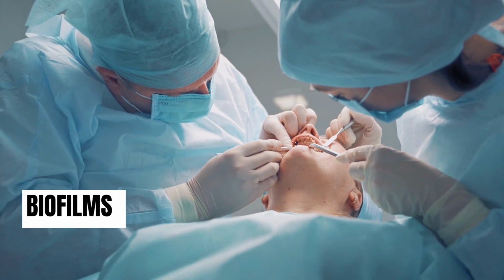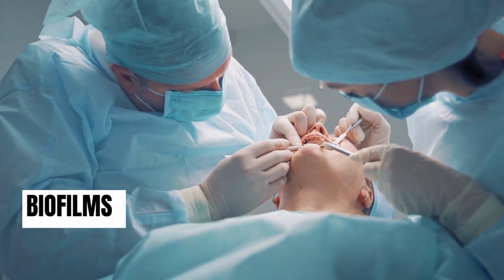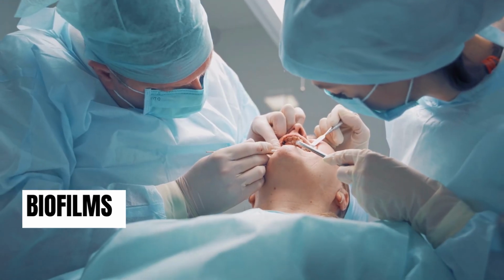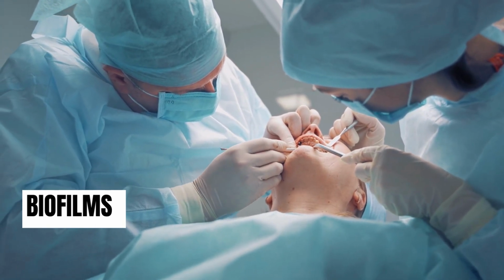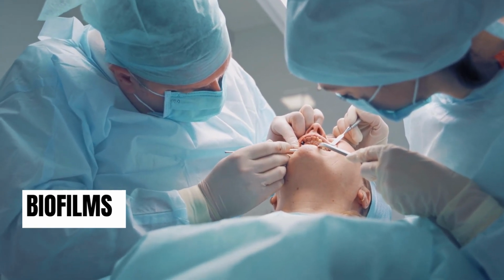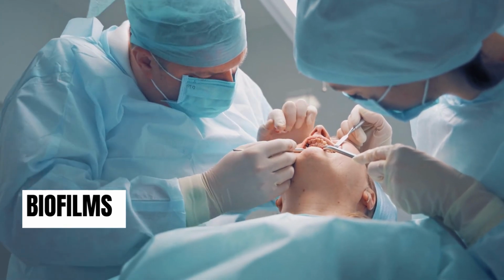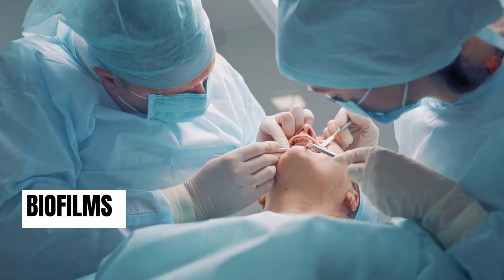The dental chair consists of water reservoir bottles to supply water to the dental unit waterlines. Now, these bottles are filled with water and they easily get contaminated with bacteria which is present on the skin of people, such as Staph epidermidis and Staph aureus. Dental unit waterlines must be cleaned periodically.